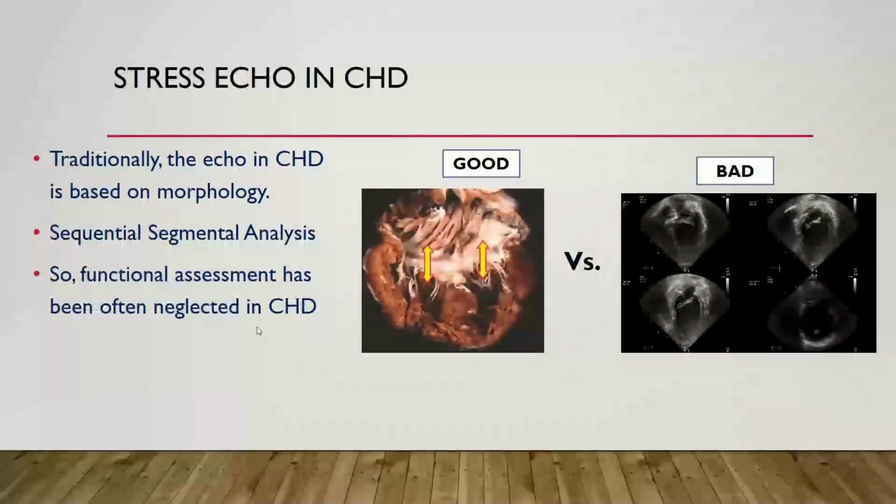Though it's not considered classically an advanced echo modality, stress echocardiography in congenital heart disease is often overlooked and not so much used. This is related to the fact that traditionally echo in congenital heart disease is based on morphology. We all know very well all the rules of the sequential segmental analysis, but then functional assessment has often been neglected in congenital heart disease.